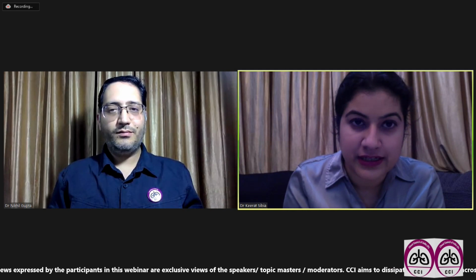So thank you for that answer. Here's an input from our very beloved Dr. Tridip Chatterjee from Mumbai, Maharashtra. Sir is saying, before checking hilar enlargement, always check rotation of the film. Thank you, sir. This is a very important point indeed. Every postgraduate and every practicing physician needs to remind themselves over and over again, when we see the chest X-ray: is the exposure right? Is the rotation right? We need to see the centering. These are the points which are not to be missed. We have to start from the basics, and hence the webinar chosen for today, Back to Basics.